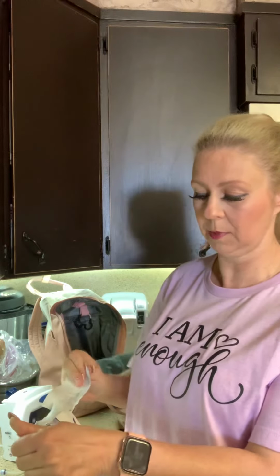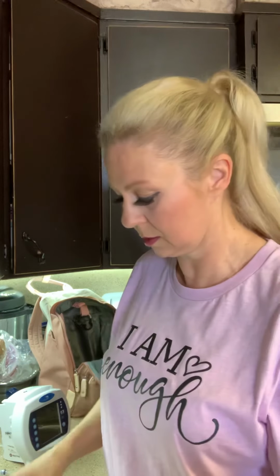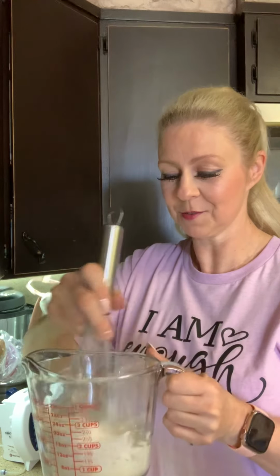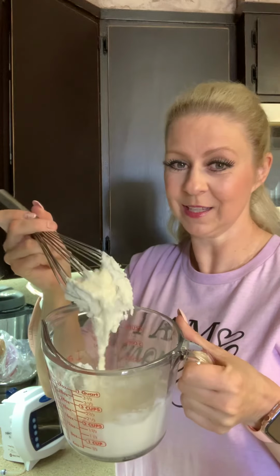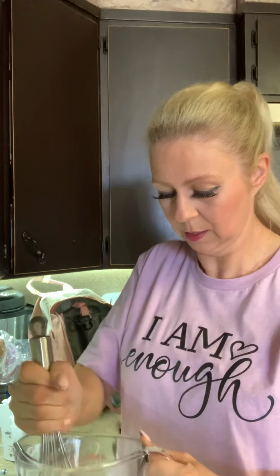What I'm going to do is add the powder to the water, and then mix it. It's kind of a thick paste a little bit. When it's all mixed up and ready to put in the bag, it's about 900 milliliters, cc's, whatever you want to call it. This stuff is really strong. So this is what I'm doing. You can kind of see the paste, and as I stir a little bit more, it gets a little more liquidy.